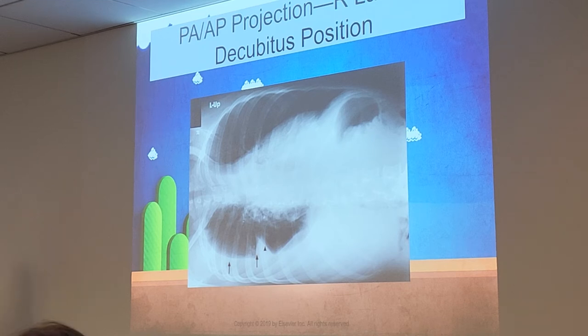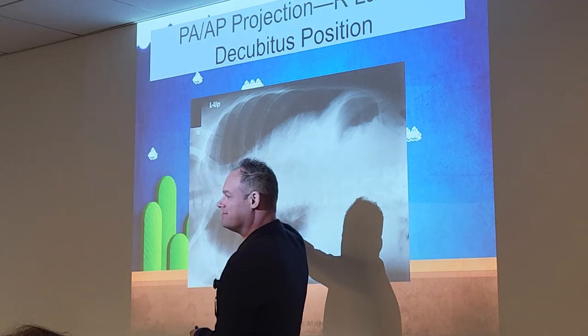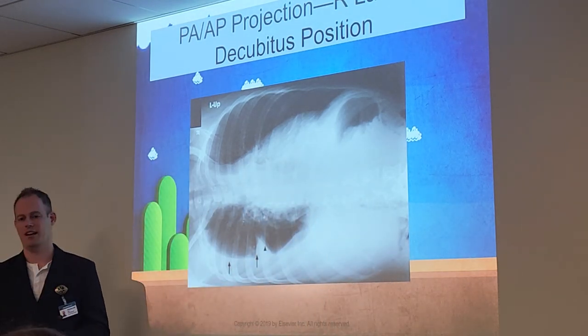Where would the carina be? Oh, the carina. We can't really see it, but it's going to be about right here. Carina, most of the time you're going to see on your obliques.